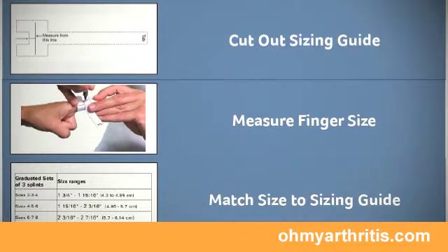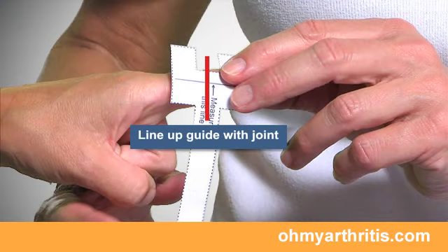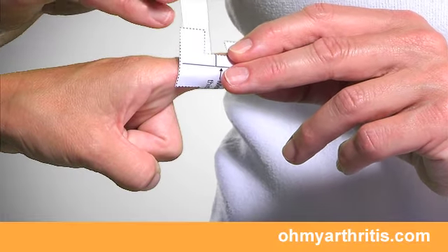Take the guide and line up the center of the notch with the center of the joint. Wrap the tab around the finger and through the notch.